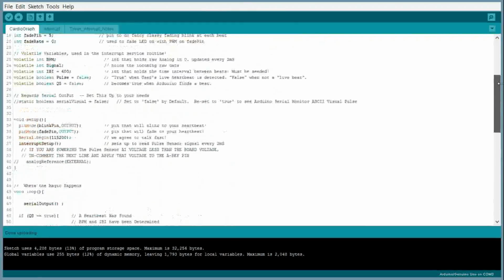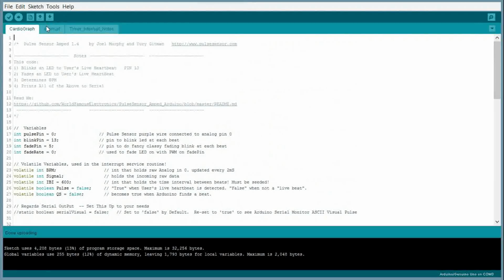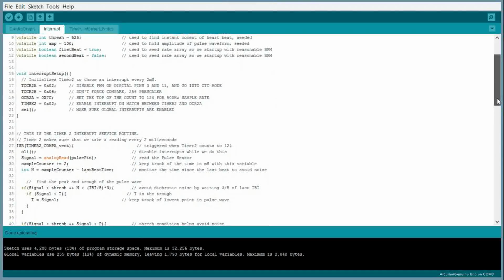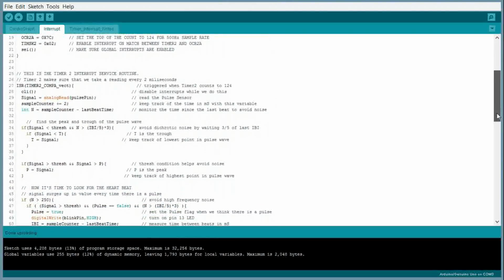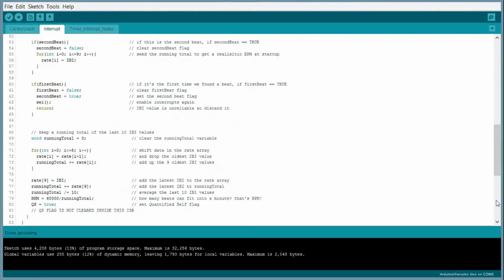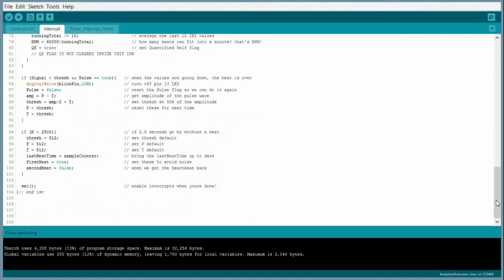So I'll show you what else we have here. We've got some interrupt code. Again, I did not change any of this. I just set up the correct pins. You just plug this pulse sensor into the correct spots on your Arduino, and it should work fine. I'll just scroll through this really quick so that if you want to copy this code down before I get it uploaded, you can do so. But I will post a link to upload or download this code on GitHub. Just give me a little time.